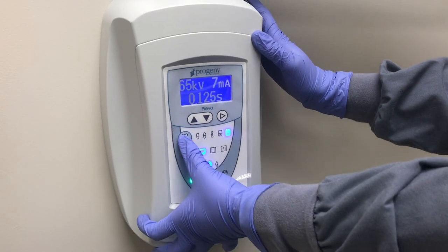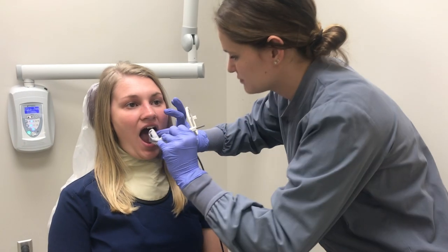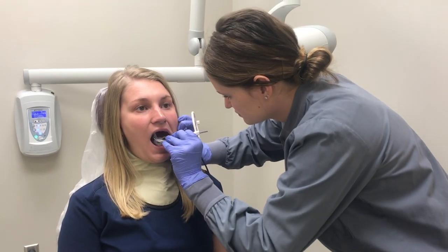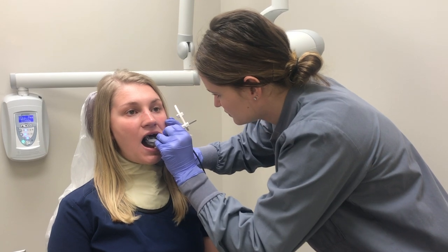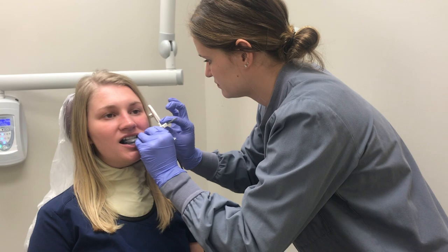On the control panel, select the premolar and adult setting. Position the device in the oral cavity. Make sure the sensor is parallel to the long axis of the tooth and have the patient bite down slowly, ensuring that they bite down all the way.